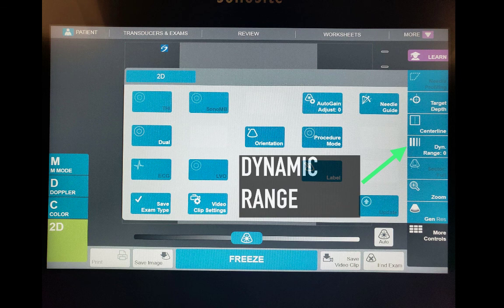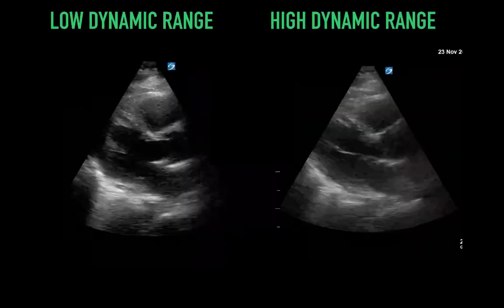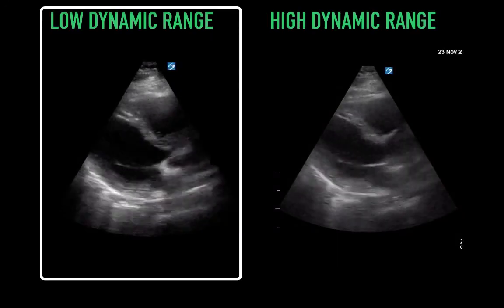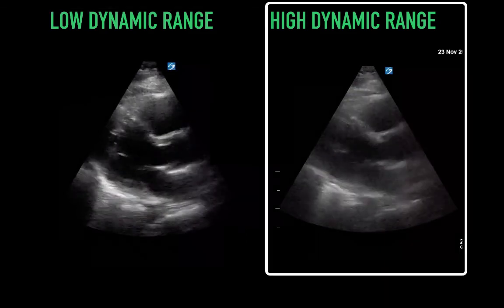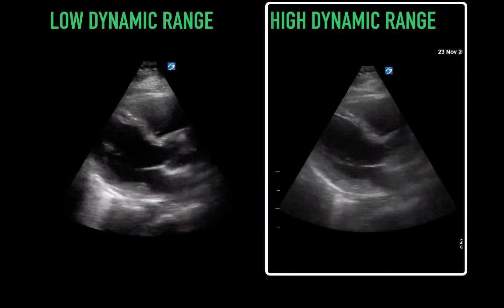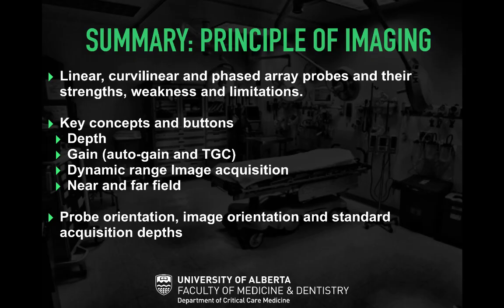Dynamic range is a button few are familiar with but it helps adjust your gray scale. Increasing the dynamic range means more shades of gray, which can make tissue boundaries easier or more difficult to see. Low dynamic range means less gray spectrum, making tissue boundaries easier to see; high dynamic range means more colors across the gray spectrum, making tissue boundaries more challenging to distinguish. In summary, we covered different probe types and key concepts like depth, gain, dynamic range, and near and far field.